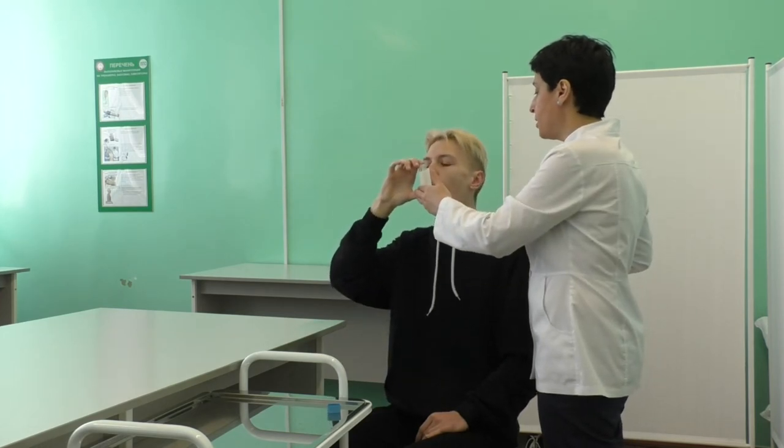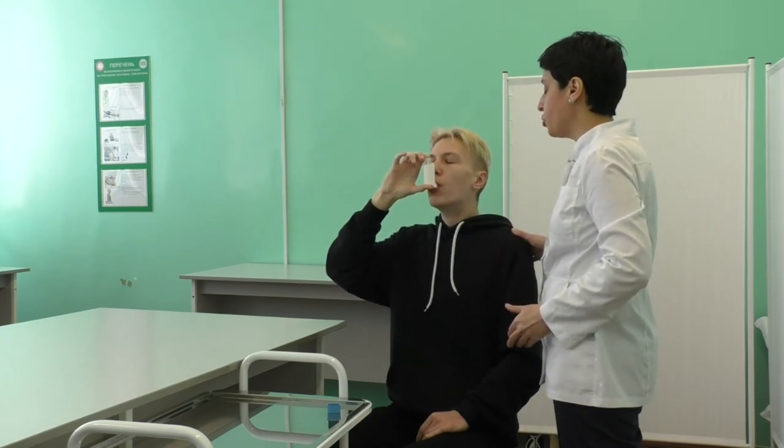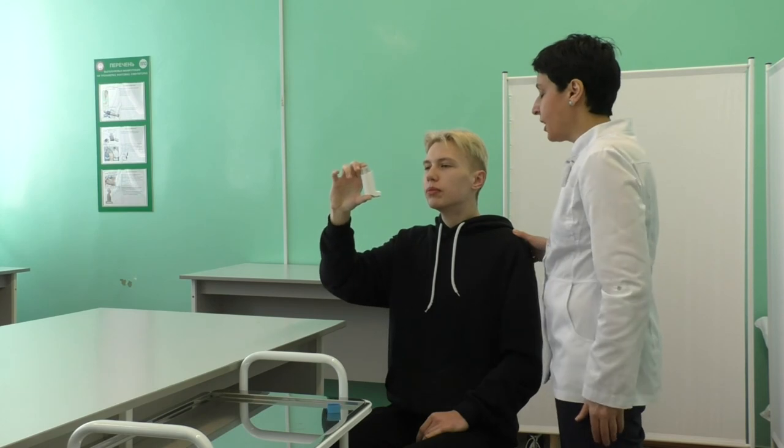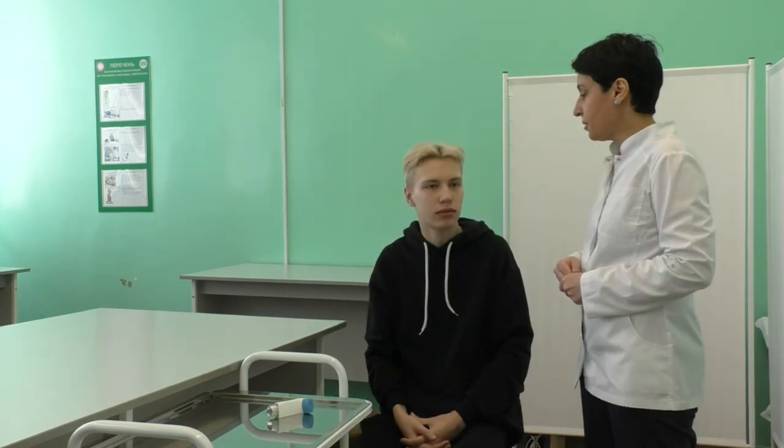Take a deep breath and simultaneously press on the bottom of the canister. Press down the canister with your index finger to release the medication. Recommend your patient to hold their breath for as long as comfortable, 5 to 10 seconds, and then exhale.